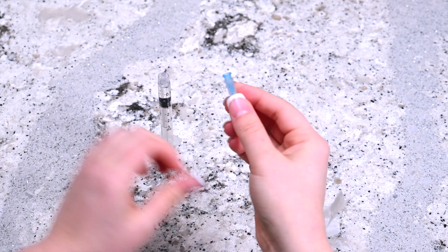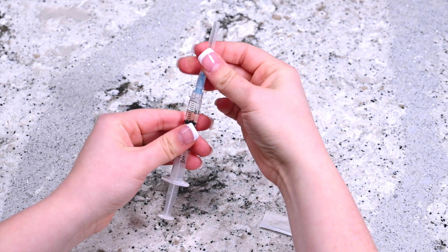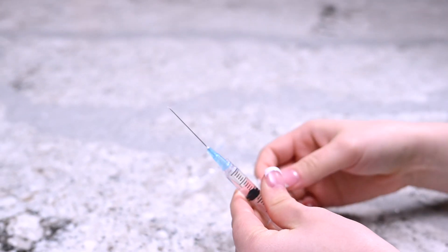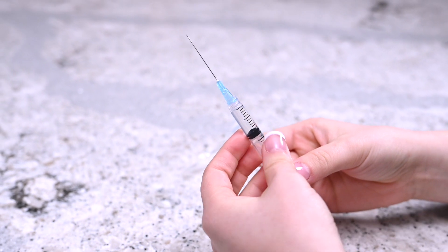Remove the needle from its packaging. Twist it into place on the top of the syringe. Hold the needle upright and remove the cap. Don't let the needle touch anything, including your hands.